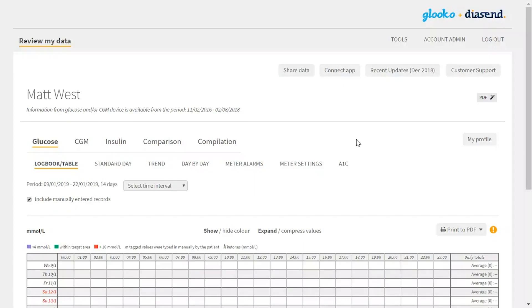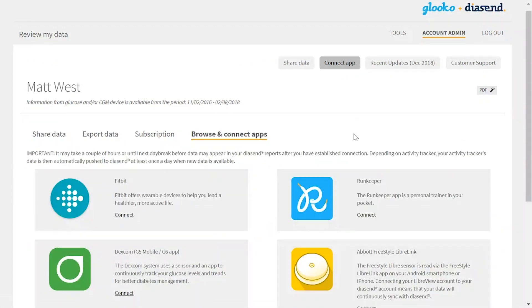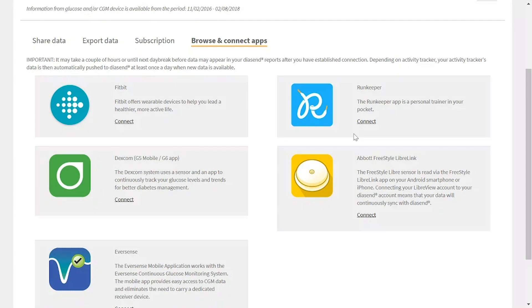Once a patient has created a personal Diacend account, they have the ability to connect third-party applications. They can do this quickly and easily by going to the connect app button at the top of the screen. On this screen they will then be presented with a list of third-party applications, which we continually update.